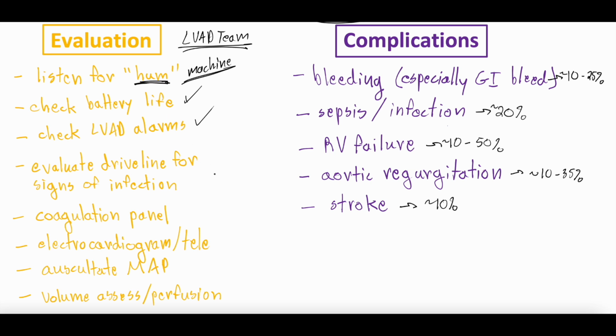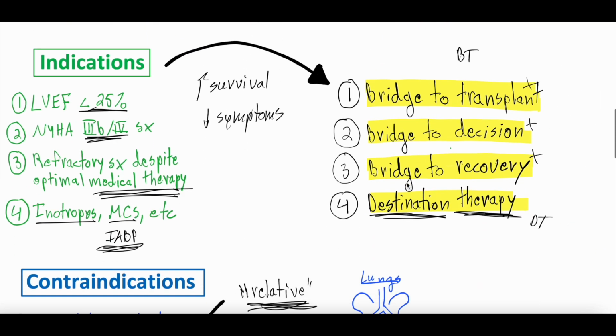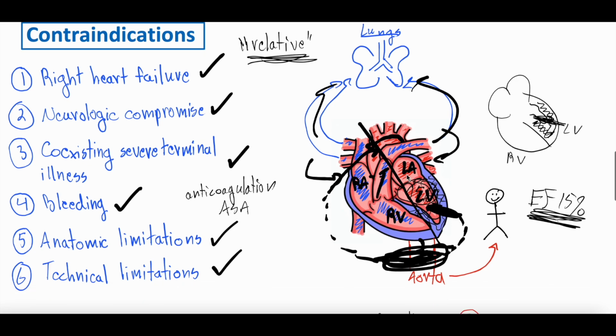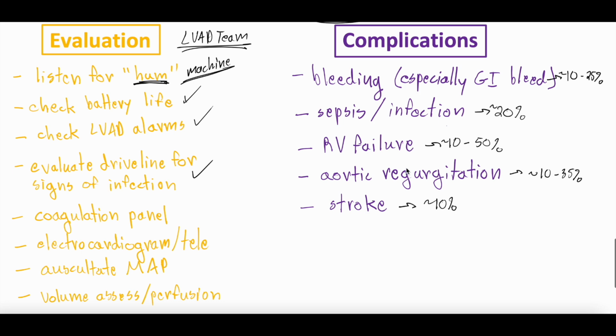Also look at the drive line for signs of infection. I'm going to scroll back up to that picture to remind you all what the drive line is. Right, the drive line is literally this line that goes from inside the patient's body on the pump of the LVAD, goes through their abdomen, comes out the skin of their abdomen, and plugs into the controller unit. So that's the outside world, right, communicating with the inside world, because that drive line comes out of their body, goes to the controller unit, and obviously from the controller unit, the drive line from outside the body goes back in the body, in the abdomen, to the actual LVAD itself.